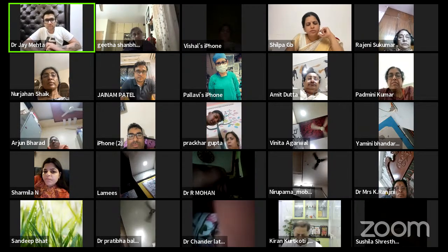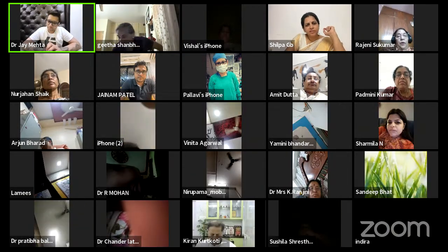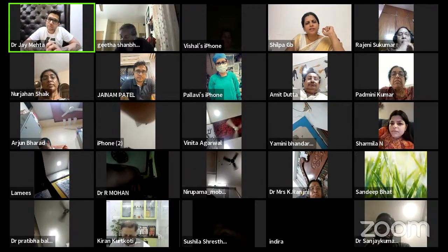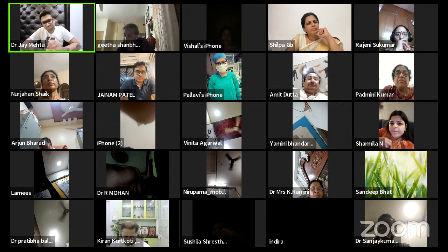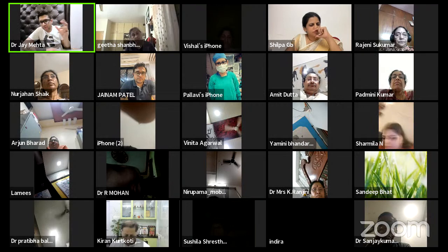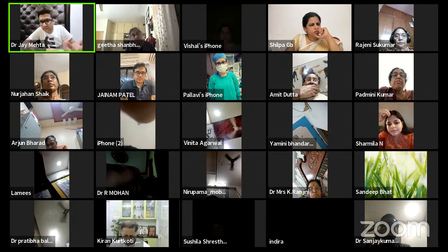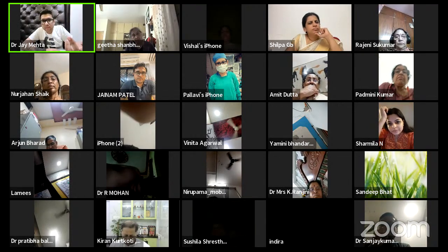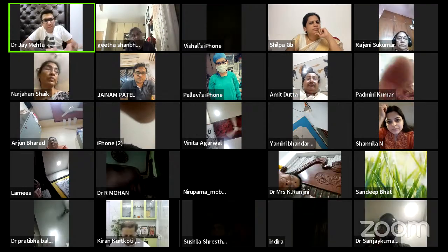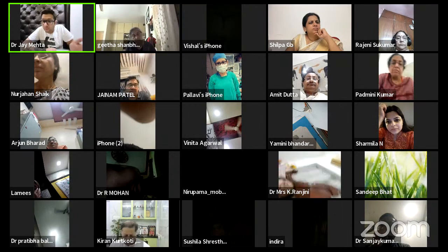Yeah. So if there is a difficult embryo transfer, do you post them for hysteroscopy in the subsequent cycle? Is there any criteria? We don't do that, madam. If it is a difficult embryo transfer, it is difficult, but the embryo transfer has occurred, right? Then if the patient is not pregnant, I don't see a need to do a hysteroscopy unless there is some obvious cause.